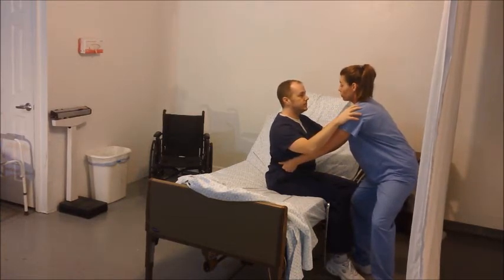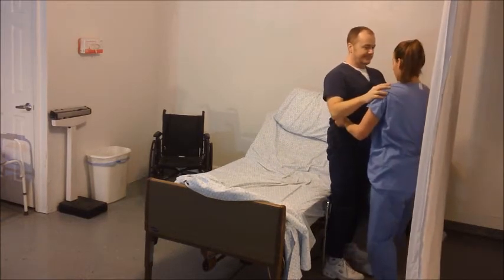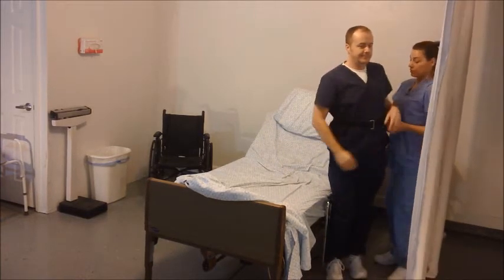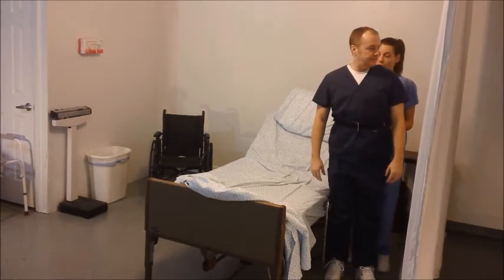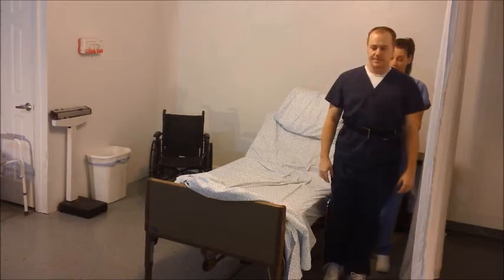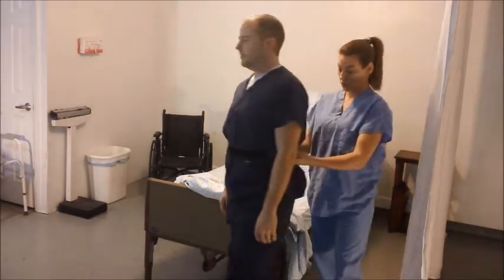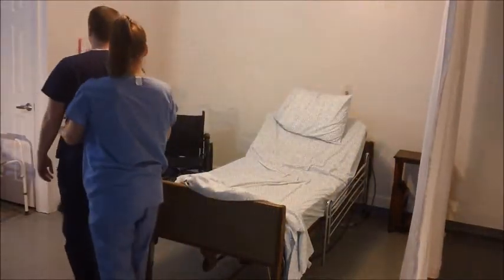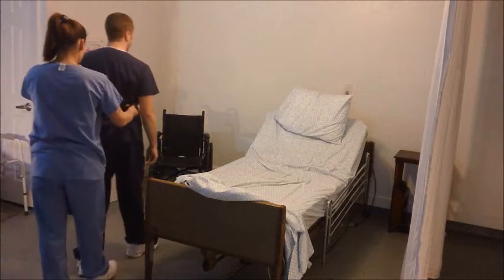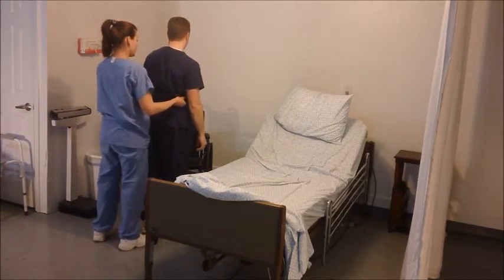Maintain proper body mechanics when assisting resident to stand and sit. Leave resident positioned in chair in proper body alignment and hips against back of seat. Ask resident about preferences during care. Use standard precautions and infection control measures when providing care. Ask resident about comfort or needs during care or before care completed.